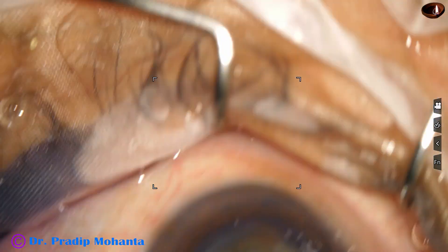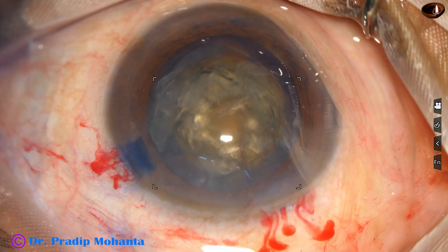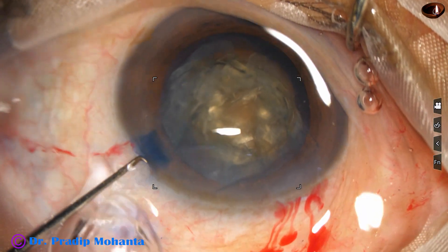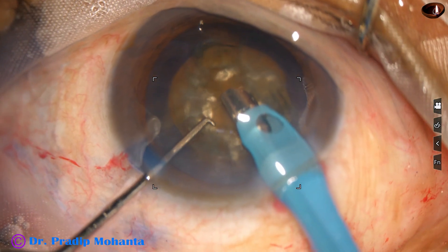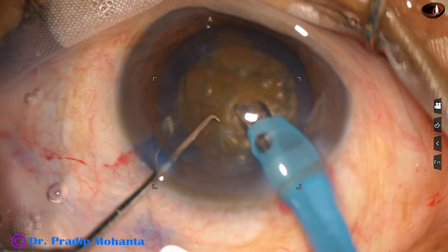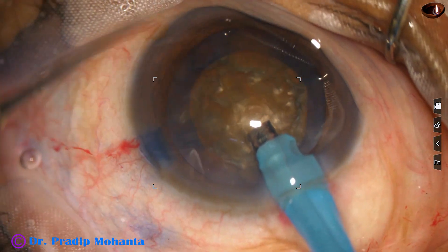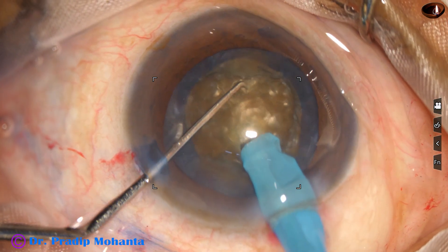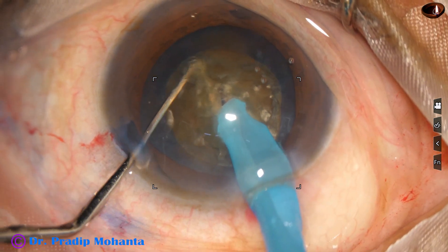Now I am going to divide this nucleus by my technique called Submarine Chop. The phaco needle goes down and some superficial cortical lens matter is removed. The handpiece is then turned to make the bevel up. The nucleus is pushed a little down by the chopper and the tip is buried just in front of the equator — into the substance of the nucleus — just as a submarine moves through water, reaching near the opposite equator.